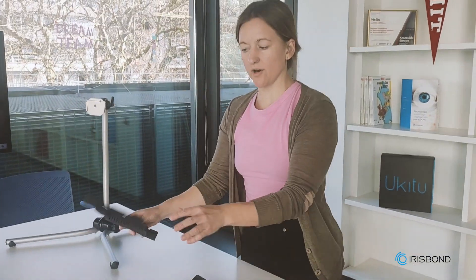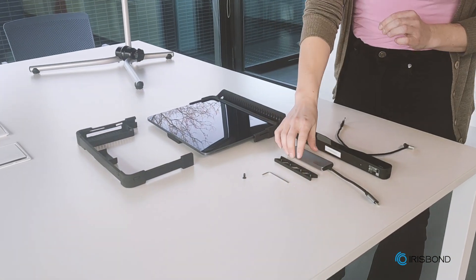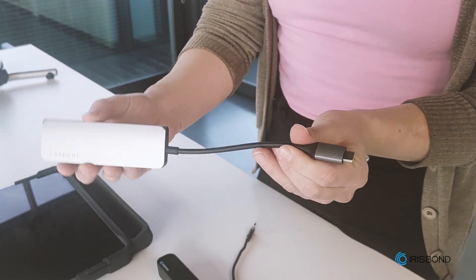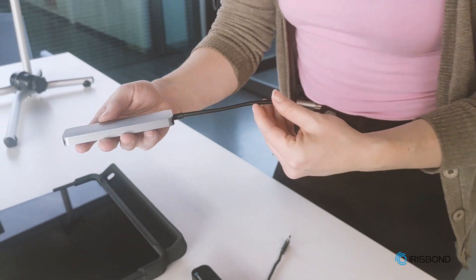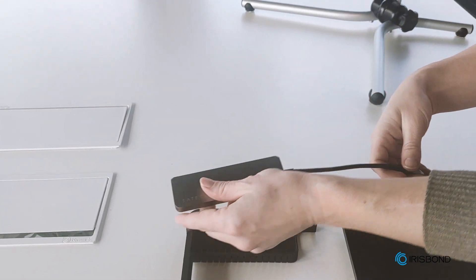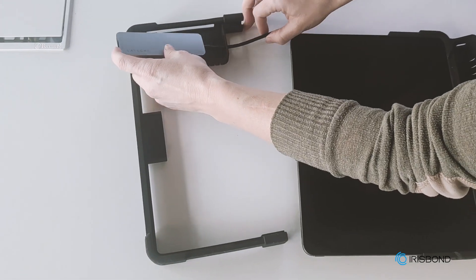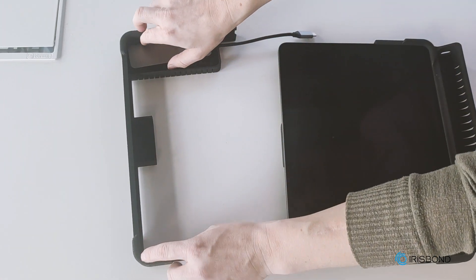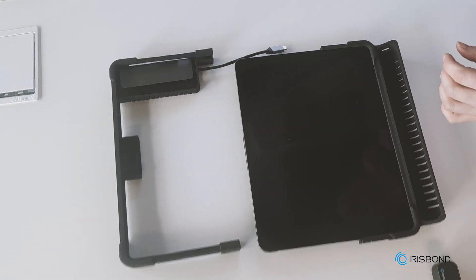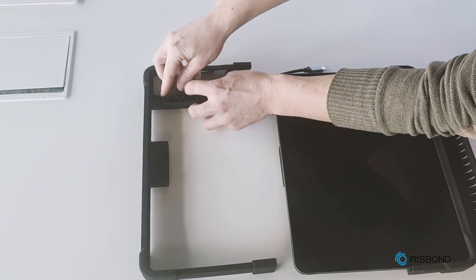Now I'll take the top part of my Osco, and before I put it together, I want to add my hub. We use a hub for the iOS version of our iDay solution. So we'll take the hub with the ports on the right side, put the cord through here, and place the hub in this space. There's also a little spring that comes with the Osco — this just holds the hub in place.